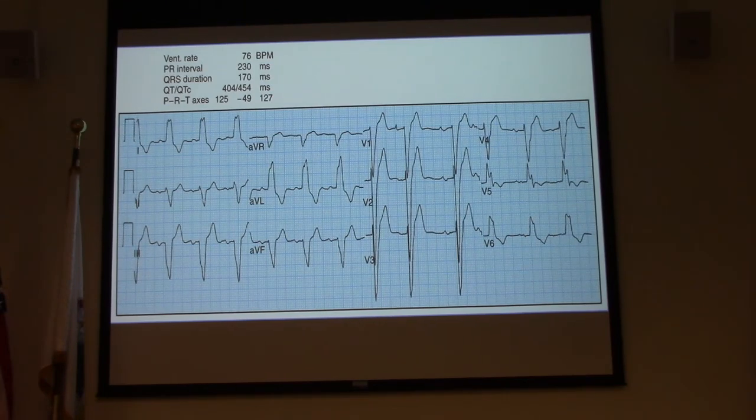Right, but this more than likely is not a STEMI. It's more of a STEMI mimicker. I would say I've got a patient with a left bundle branch block, and that's going to be a little bit more accurate to say than someone who has a STEMI. A patient with a left bundle branch block is not as immediate as someone who is having a STEMI.